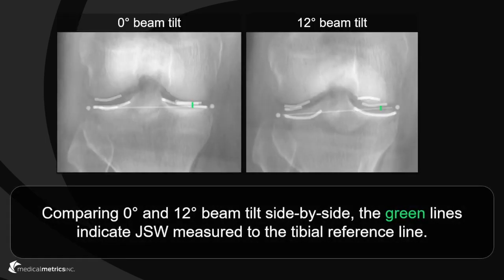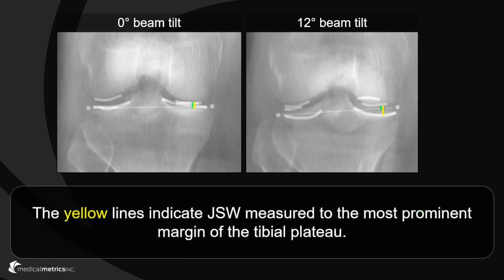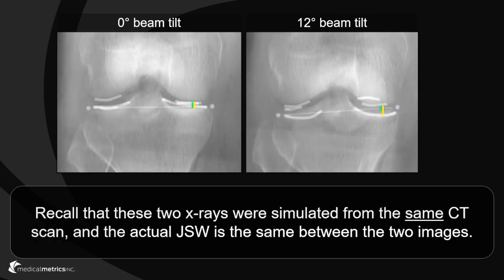Comparing radiographs at 0 degrees and 12 degrees of vertical beam tilt side by side, the green lines indicate joint space width measurements in the mid-coronal plane. The yellow lines indicate joint space width measured using the most prominent radiographic shadow of the tibial plateau. Note the differences in joint space width between the two methods for 0 degrees versus 12 degrees of vertical beam tilt. Recall that these two radiographs were simulated from the same CT exam, so the measured joint space width should be the same in both radiographs.